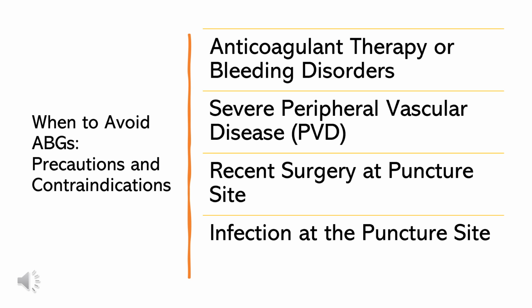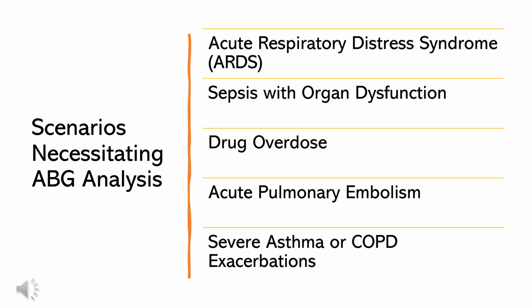Each of these points offers not only a reason to avoid ABG, but also provides a broader context, underlying scientific rationale, and potential alternative actions to take. This equips you to make sound clinical decisions. Now let's look at some scenarios that necessitate ABG analysis.